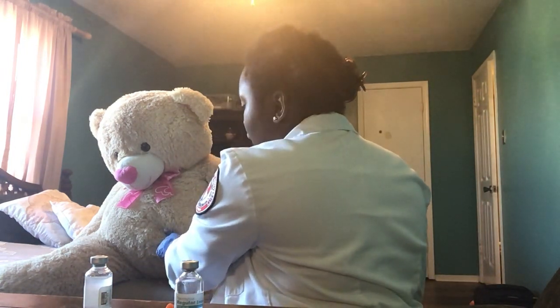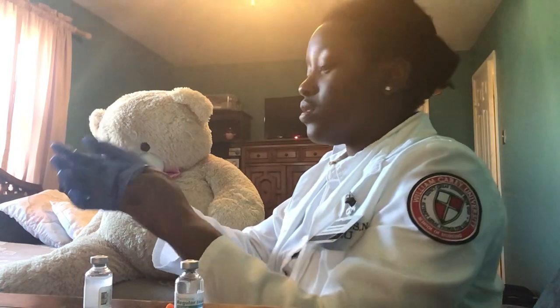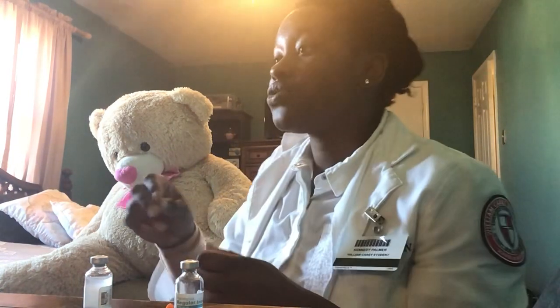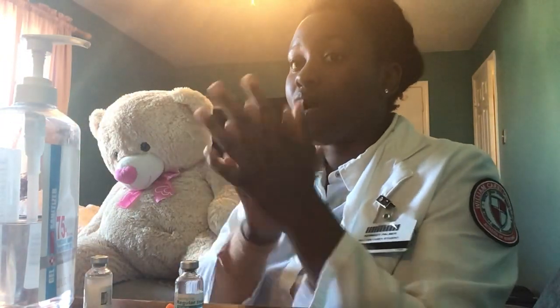Okay, and after I apply pressure to it, I am just going to dispose of my gloves and the swab in the biohazard bin as well. I'm going to perform hand hygiene or wash my hands with soap and water, and I am going to document this procedure and document how the patient handled the procedure and how much insulin I gave.